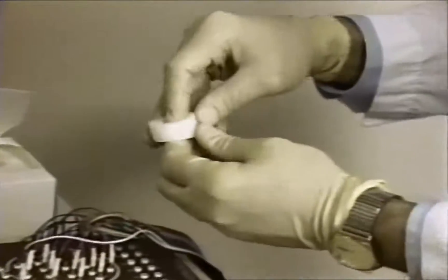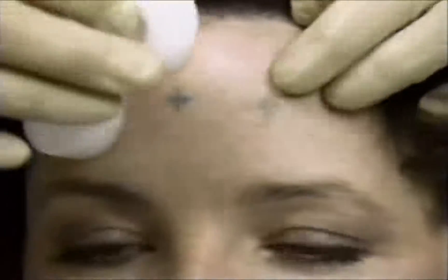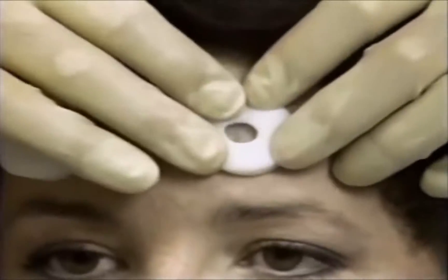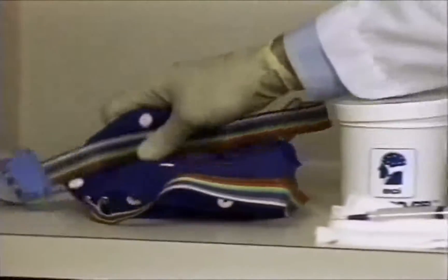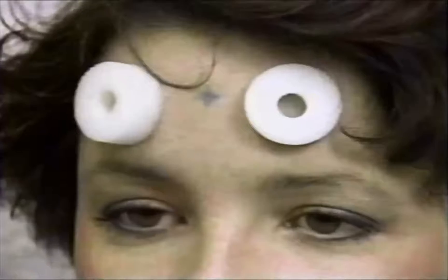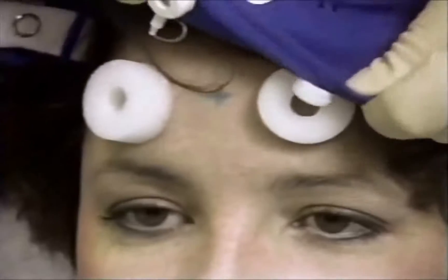Place the sponge discs over the FP1 and FP2 marks — these will absorb perspiration and reduce movement of the electrodes. We are now ready to place the electro cap on the patient's head. Set the FP1 and FP2 electrodes into the sponge discs on the forehead.